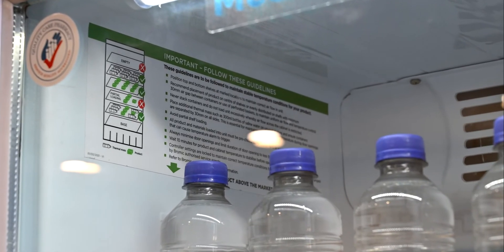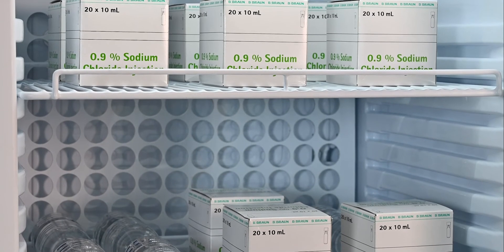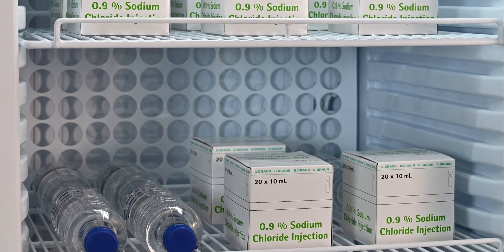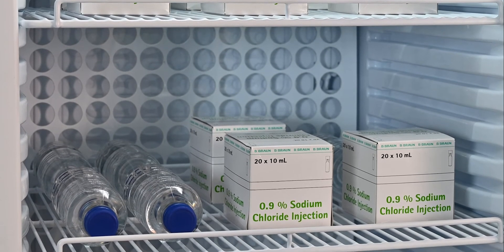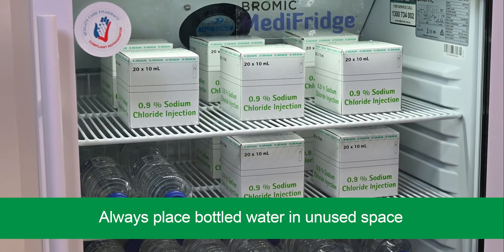Never stack containers and do not load the fridge to excess, as it obstructs cold air circulation and decreases your Medi-Fridge's ability to maintain a stable temperature throughout the unit. Always place cold mats such as water bottles in unused spaces — it is essential for maintaining the correct temperature when a door opening occurs.